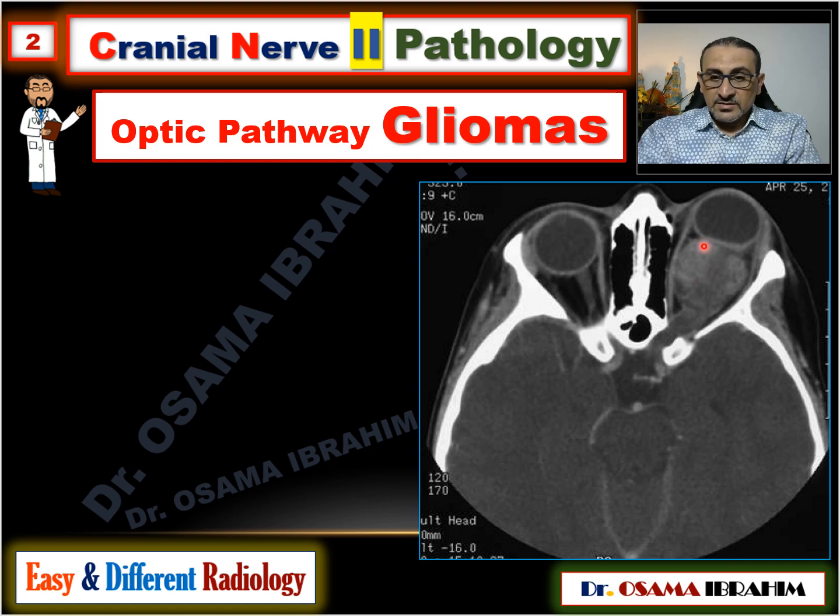Like this case of optic nerve glioma, it is called better optic pathway glioma because the optic nerve itself or its pathway through the chiasm, tract and optic radiation, any part can have glioma on it. Optic pathway glioma is a very proper description for that glioma.